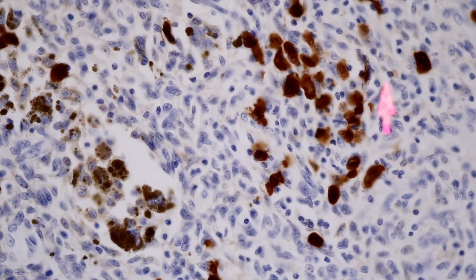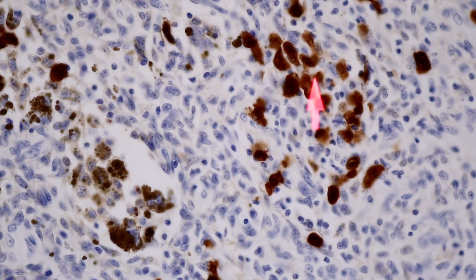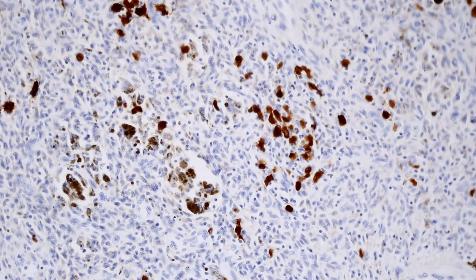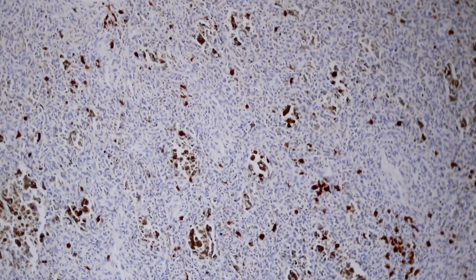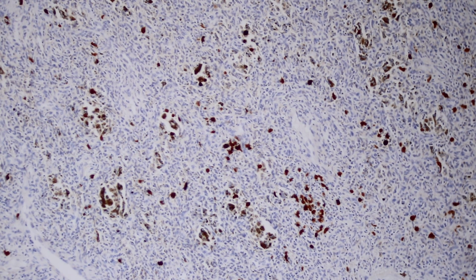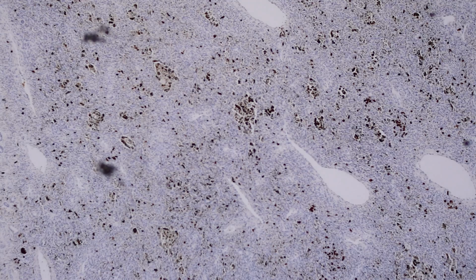Whereas the immunostain is much more fine, even staining of the cytoplasm and also of the nucleus, because S100 stains nuclei and cytoplasm usually. So again, with practice, you can usually tell apart brown immunostaining from background pigment, but it takes a little practice and you have to look closely, and it's not easy to do from low power. So that's why if there's a lot of pigment, I usually prefer to use a red chromogen if it's available in my laboratory. All right, so that's a good example of S100 dendritic cells in an aneurysmal dermatofibroma.